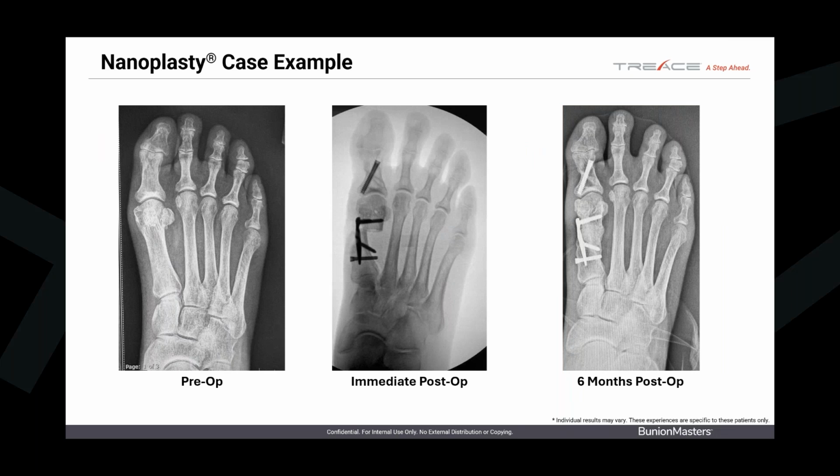And I think we're lucky if we have 10 to 12 non-unions out of all those cases. So it's very, very rare. And so you can feel comfortable that this shift produces results and it does heal with any kind of modality of post-op recovery you want. It is strong. Just be careful about patients with poor bone stock or weak bone.